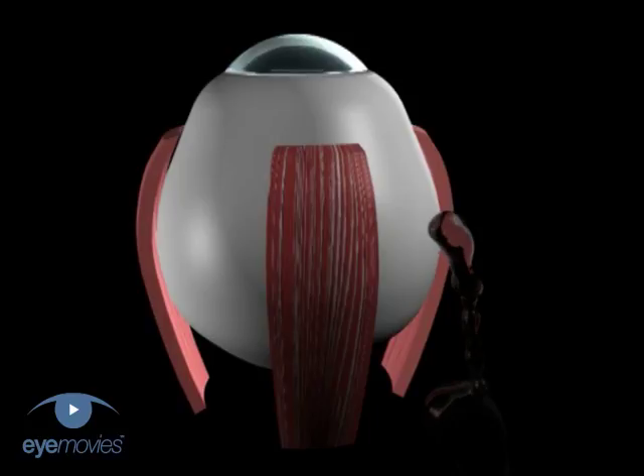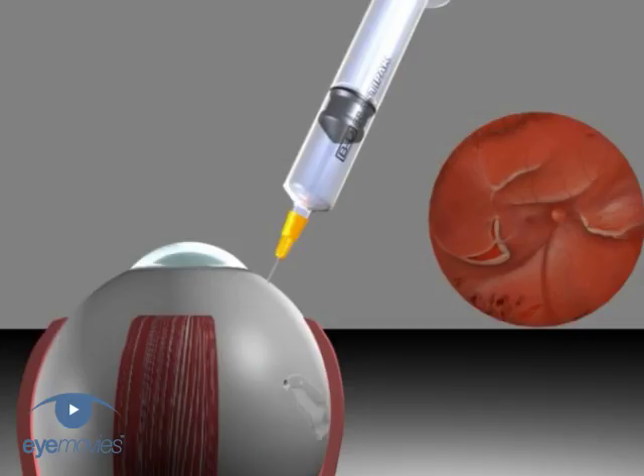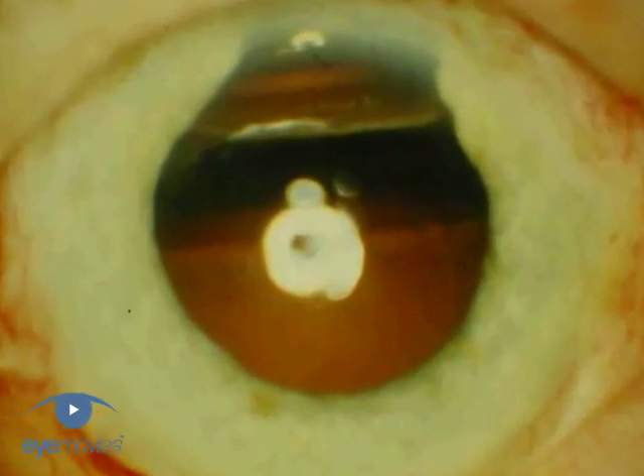While it is possible to do this with saline in the presence of smaller retinal breaks, the injected fluid will quickly leave the eye if there are large breaks which offer little resistance to fluid egress, and the hypotony will recur. In this situation, the globe may be reformed by an air bubble whose surface tension will prevent its passage through the break.